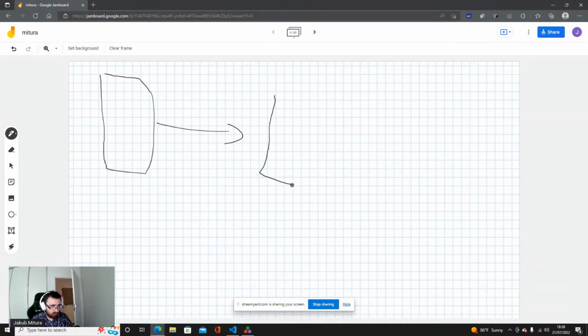So it can be, for example, an affine deformation, which would change the shape. We can change intensity, we can rotate it, we can slice out some of the parts. There are a lot of possibilities for how we can augment the data, by modifying it to get the possible variability that we expect.